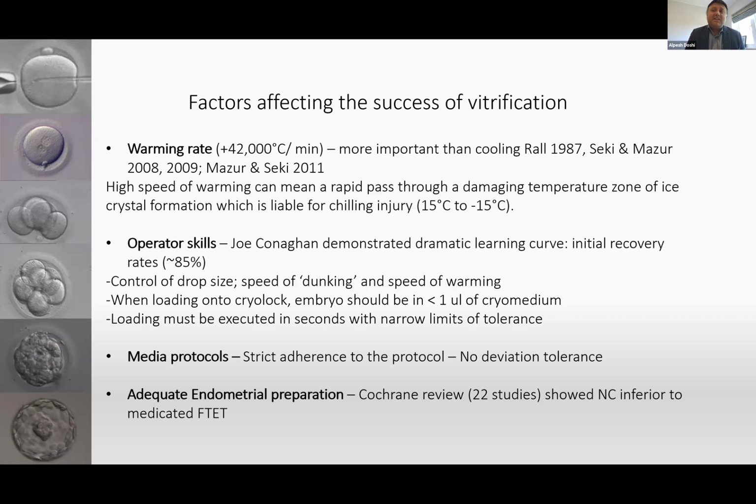And again, I want to tell you something which is quite important to me. Please don't take our word for it that, oh, it works in my lab, so you can do the same thing. I highly encourage you all to validate your own protocols in your own laboratory setting. Because it's such a multifactorial process, it may not just be the product, it may be the skill, it may be the temperature of the lab, it may be your heated stages. You want to validate the protocol in your own setting. Please do not just do it because I'm saying it. You want to make sure that you first do all the trials within your own lab before you apply a protocol clinically.